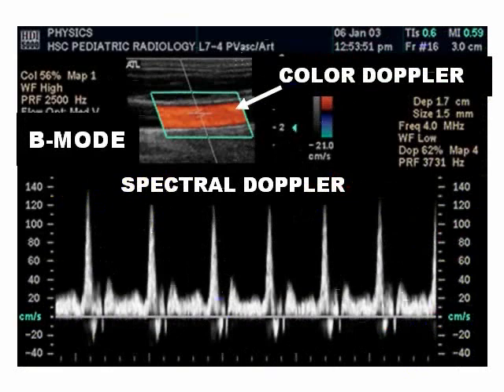In this picture we have the same, but also we have color Doppler in the B mode. That helps to know where is the area that you are going exactly to measure, because color Doppler puts color in the area where blood is moving.